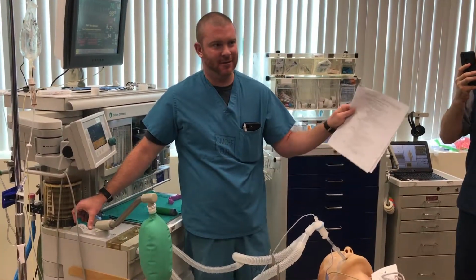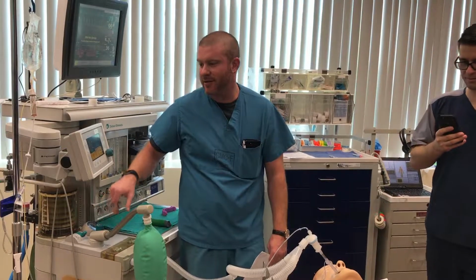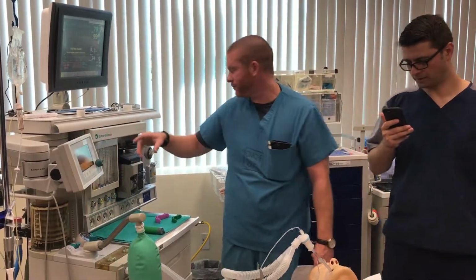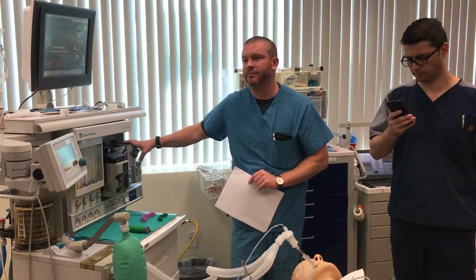No, that was more straightforward than the machine is. Yeah, this is the induction portion. This is just induction, not maintenance or anything like that. Yeah, the same maintenance, just induction. I'll tell you real quick in 2 minutes how to do maintenance. Turn on the gas. Now gas on. Oh, it's already on.